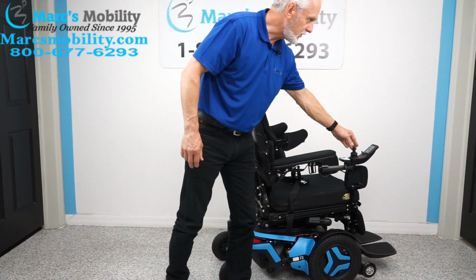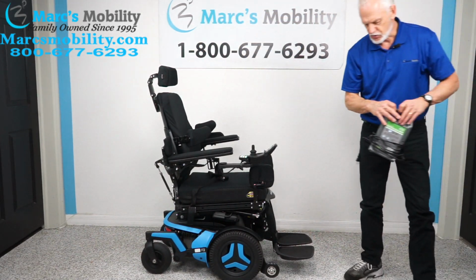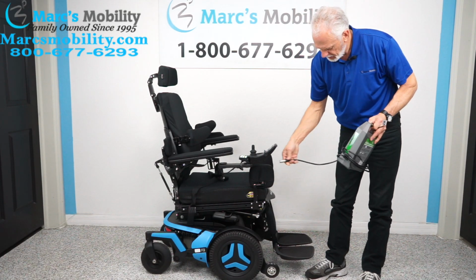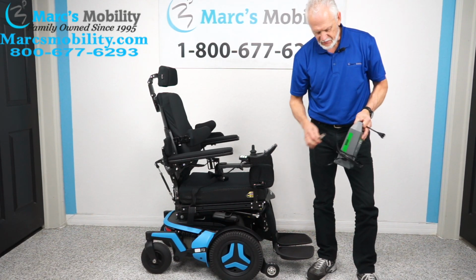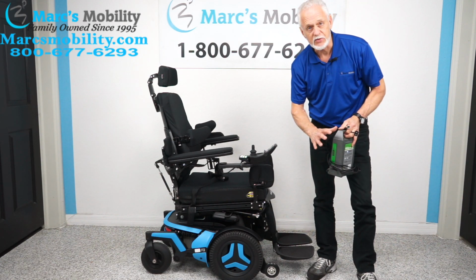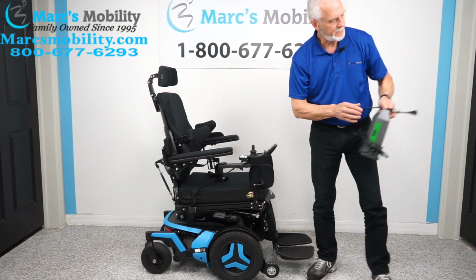When you charge the batteries on this chair, you take your Permobil charger. Now we're going to use this charger. For example, this may not be the charger, but it is a Permobil charger. You plug it right here, and as soon as the light goes to full or turns green, the charger will stop charging. These are smart chargers. They know when to stop charging.